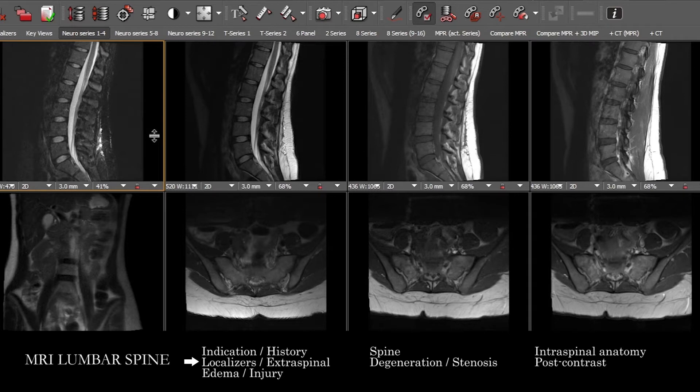Once we've taken a look at the incidentally imaged anatomy, we can go into the evaluation of the spine and things that may explain what's going on with the patient.